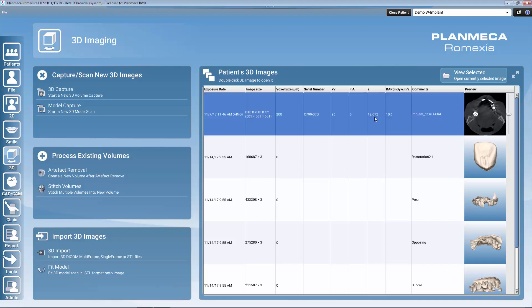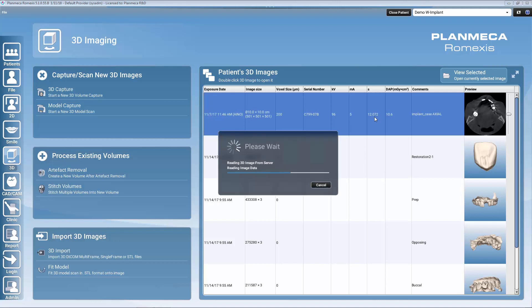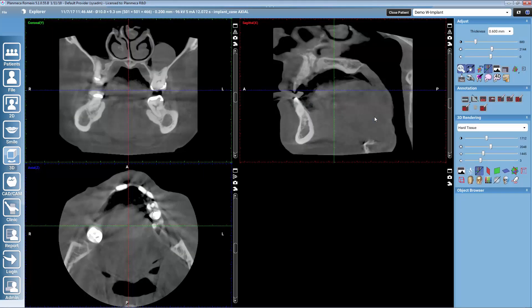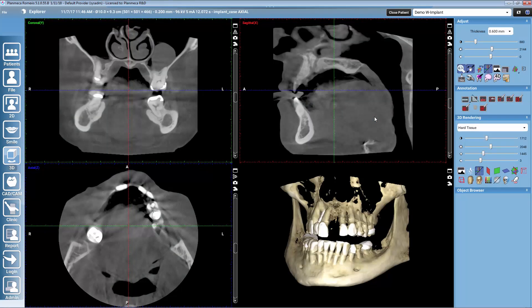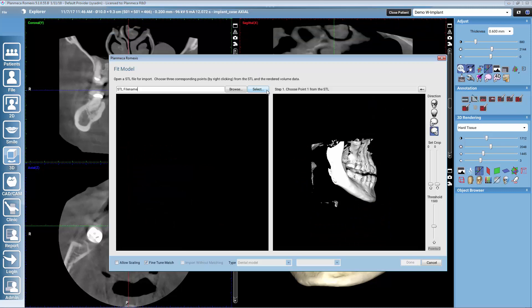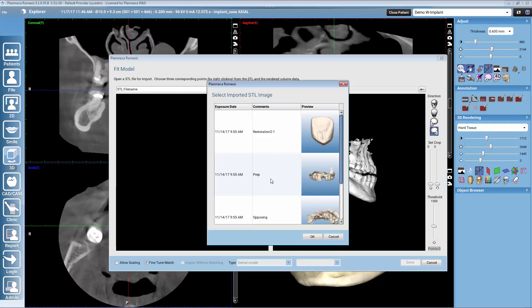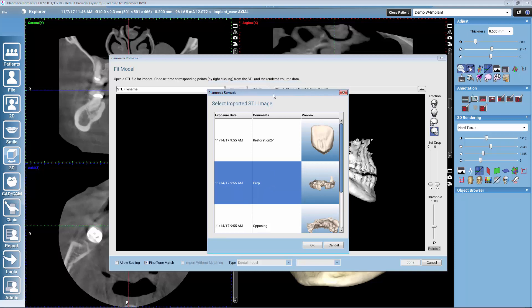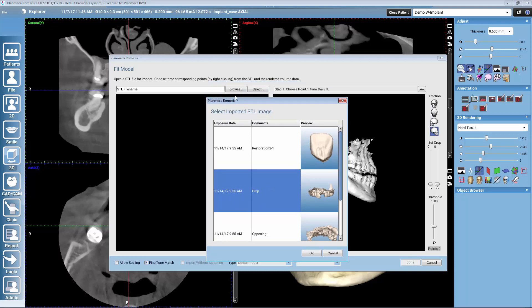First of all I will open up the 3D image for the patient, the CBCT, and we start by mapping the dental model to this image. We have an intraoral scan for this patient and we select it from the patient's data list. You could as well bring any other STL file from other systems with the browse button.